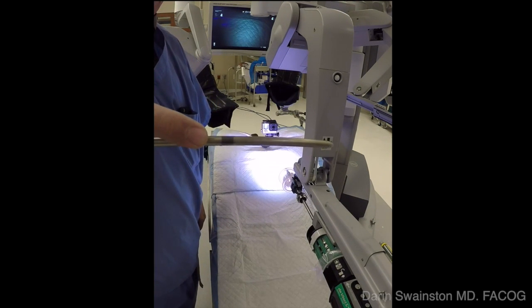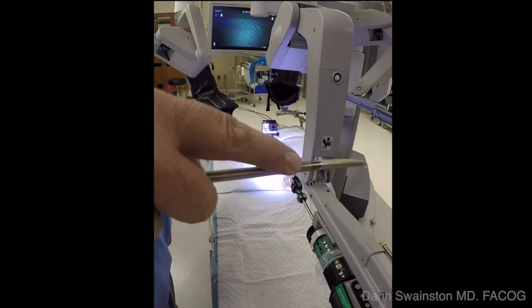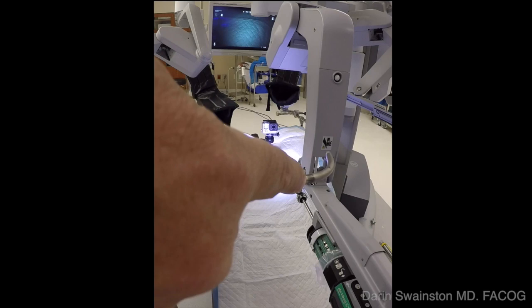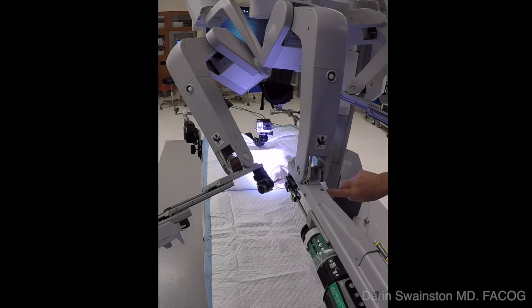You do not push past the V — you go to the V or slightly beyond. That way you don't have the trocar in the abdomen without visualizing it. You can see here as you rotate clockwise, it brings that tip right up into view.